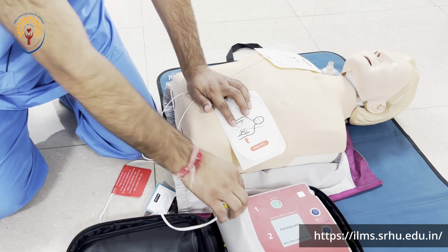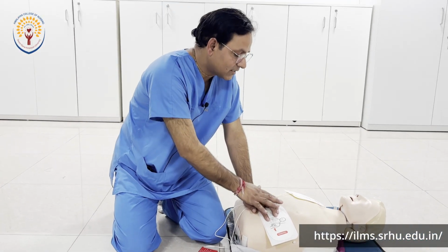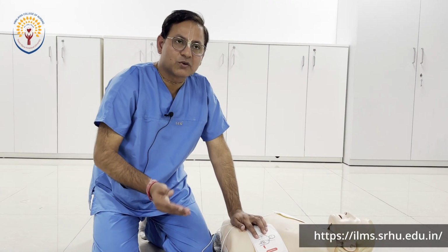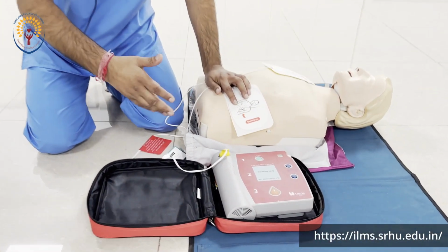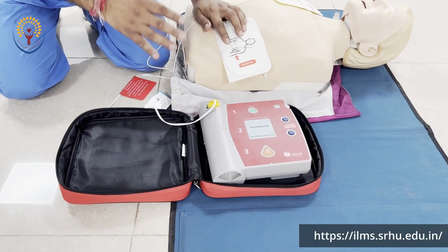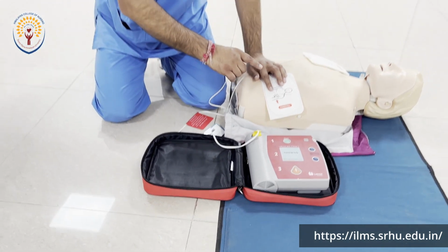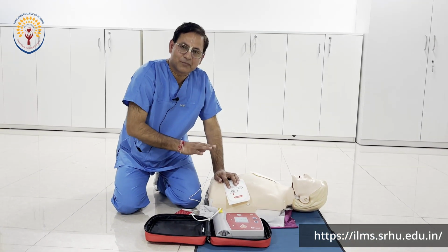After connecting, it will say analyzing heart rhythm. After analyzing, it will say the patient requires a shock or does not require a shock. If the patient requires a shock, it will say charging. After charging, this orange light will start blinking, and it will say now it has been charged, now you can deliver the shock. Before delivering the shock, we have to ensure that nobody is touching the patient.